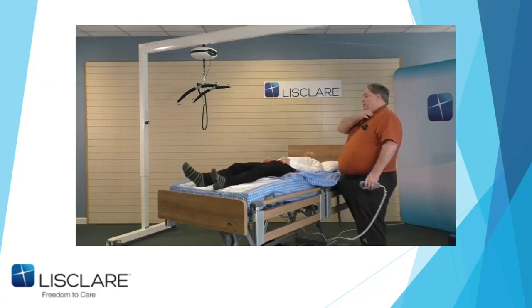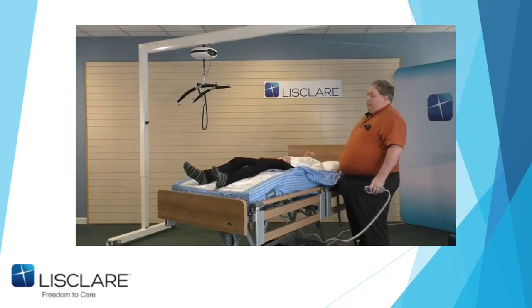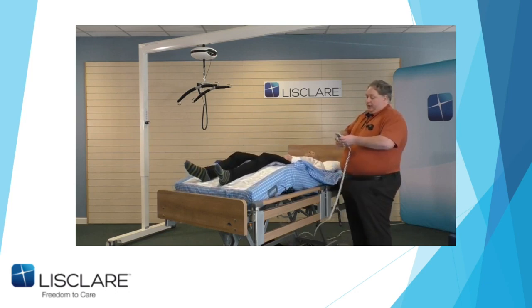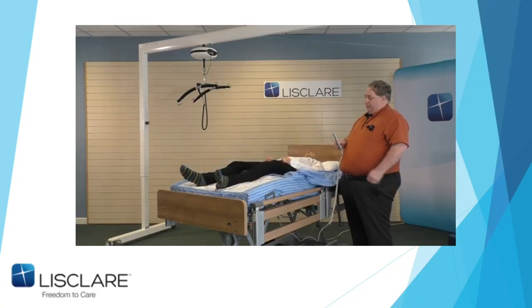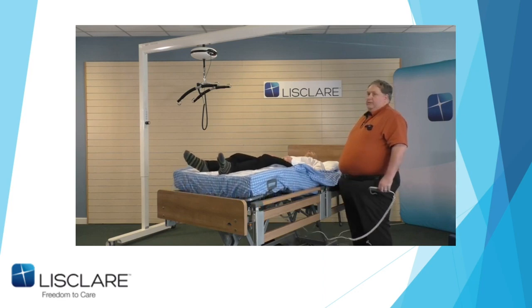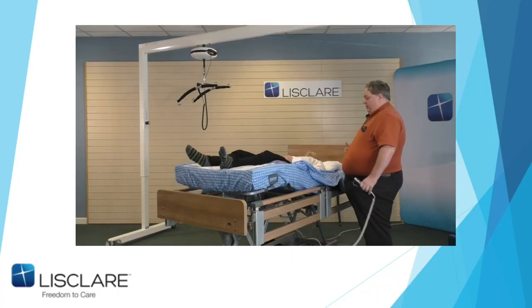And John's heels are always on the silk, so it removes any friction or shearing on the heels, whatever you want to call it. Again, I'm going to do a cheat. Listen for my three clicks. This works on most beds. There's the third click. So if I elevate that up, and hopefully you can see this with the camera angle, I've now created the slide back up the bed.